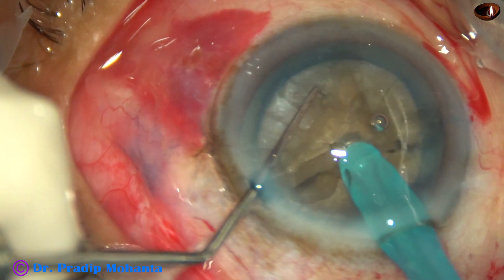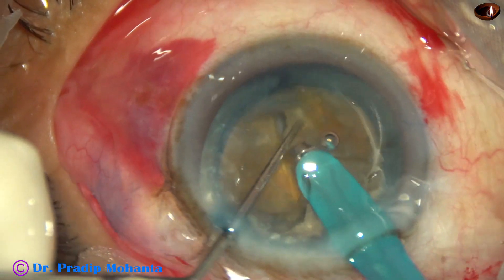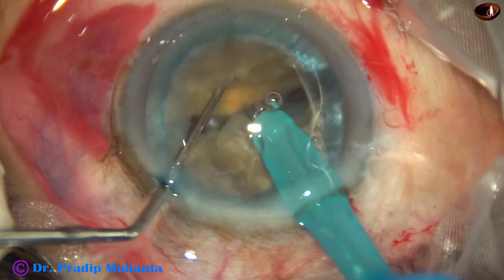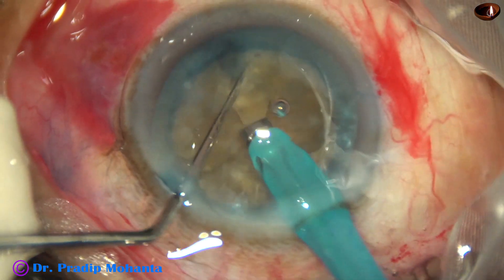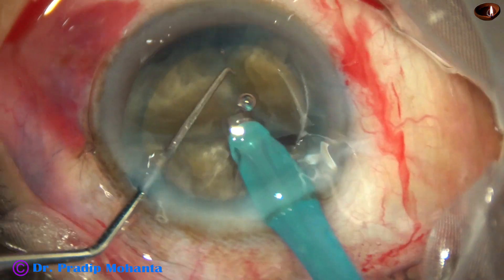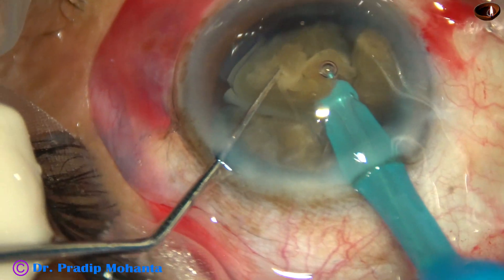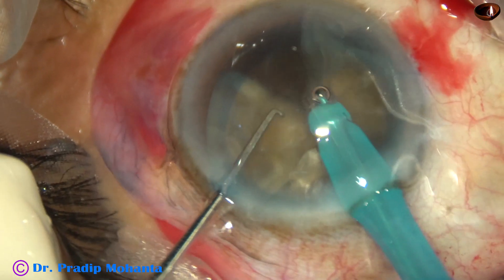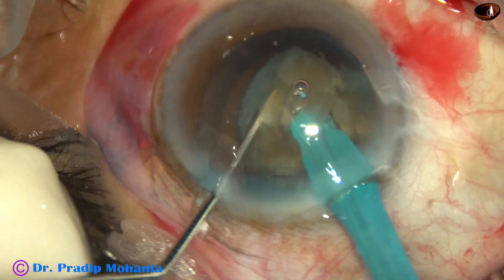And the nucleus is completely divided into two halves. Each large hemi-nucleus is subdivided into two large fragments. Always in such thick, hard nucleus, I go through the substance for a distance, and when I am sure that I have held the lens mass very firmly, then only I try chopping. Now, each large fragment is emulsified if necessary — they are again divided into two smaller parts.